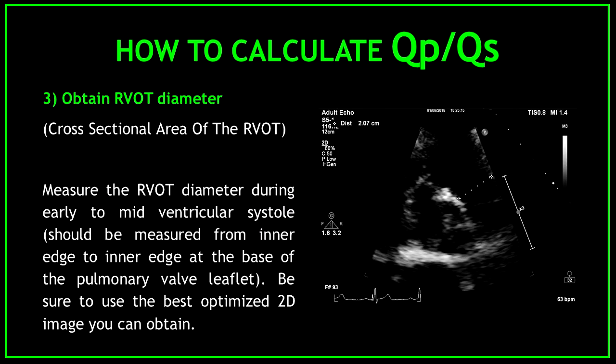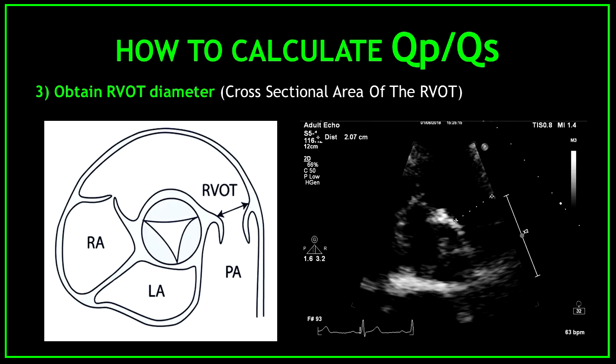Number three: obtain the RVOT diameter. This is to obtain a cross-sectional area of the RVOT. Measure the RVOT diameter during early to mid-ventricular systole, from inner edge to inner edge at the base of the pulmonary valve leaflet. Be sure to use the best optimized 2D image you can obtain. We need to obtain this measurement in order to get a cross-sectional area of the RVOT.